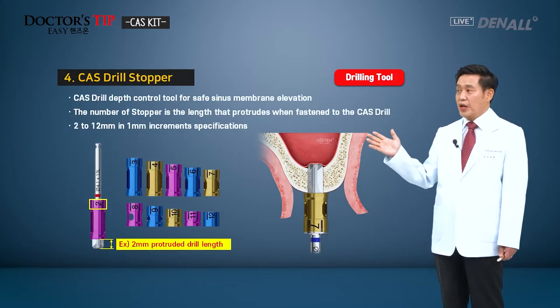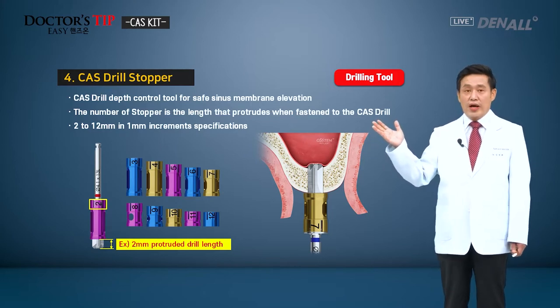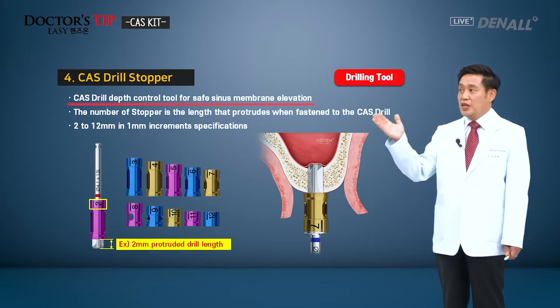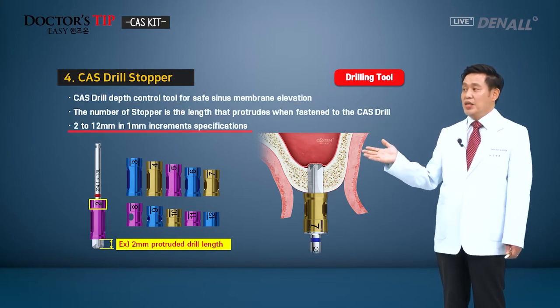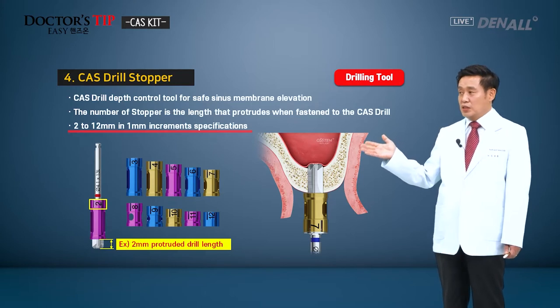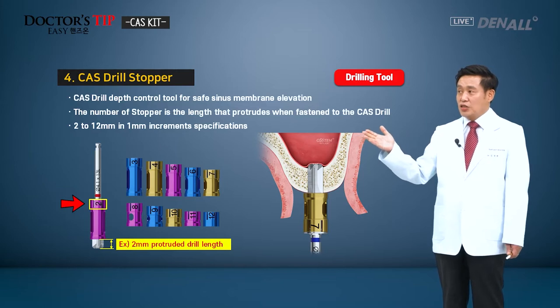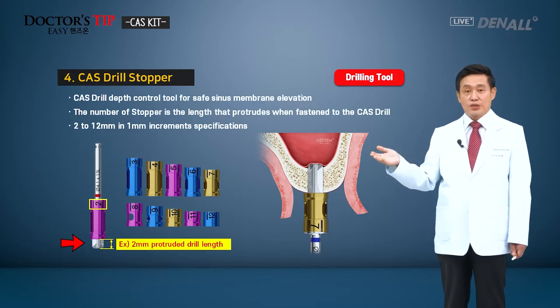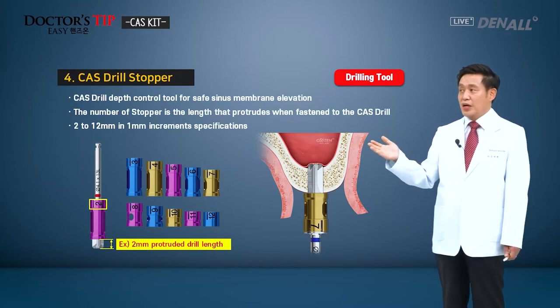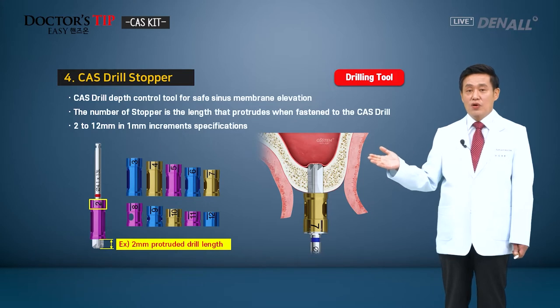The stopper is very important when it comes to the CAS drill. To lift the sinus membrane, when you attempt to penetrate into the sinus floor, it is used to control the depth of the drilling. The stoppers are 2 to 12 millimeters in 1 millimeter increments. There are two here, and you can see 2, 3, 4 marked like that. When you connect the stopper, the CAS drill's protruded drill length is indicated, and they are color-coded and laser-marked, so you can easily drill to the depth that you want using the stopper.